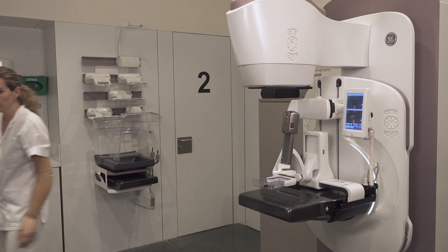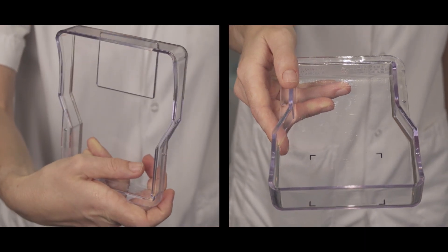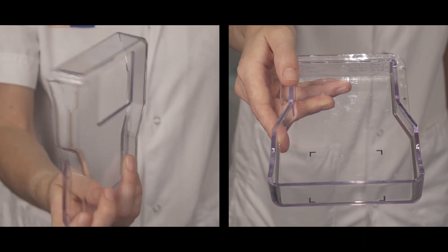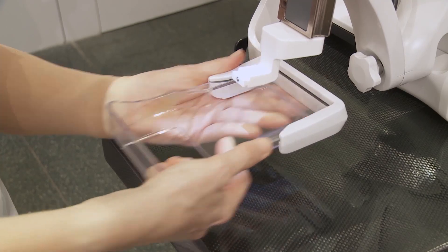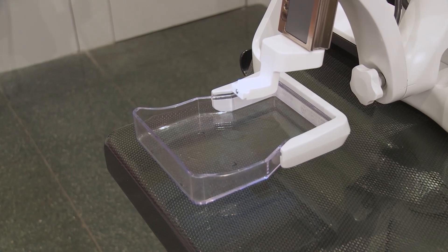Either of them can be attached to either the left or right paddle arm. If the horizontal approach is used, the vertical approach biopsy paddle with aperture is replaced by the horizontal approach one, without aperture.